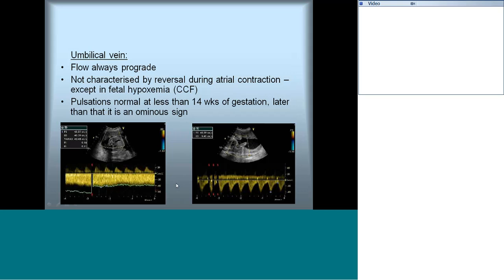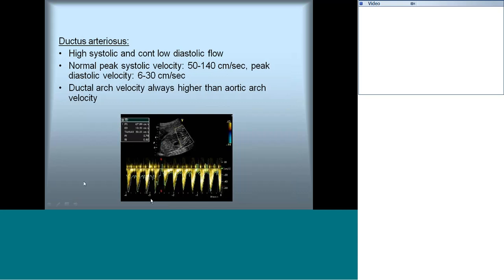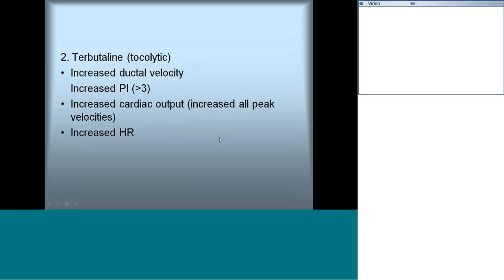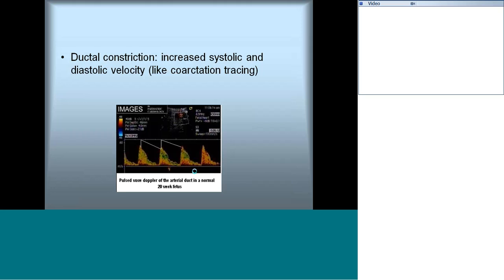Ductus arteriosus Doppler is sampled when the ductal arch is opened. The ductus arteriosus has systolic and continuous diastolic flow, similar to umbilical artery flow. Velocities in the ductus arteriosus have acceptable ranges — if they exceed these, it may indicate constriction of the ductus, which can occur if the mother is on tocolytic drugs, indomethacin, NSAIDs, or terbutaline. Ductus constriction increases systolic and diastolic velocities producing a tracing similar to coarctation, making Doppler of the ductus arteriosus important.